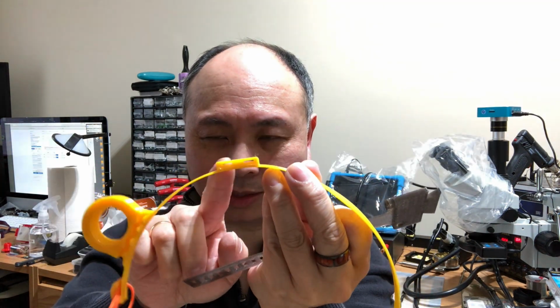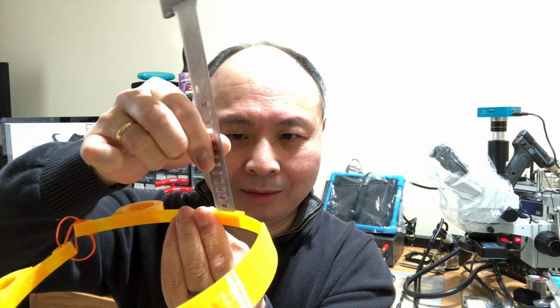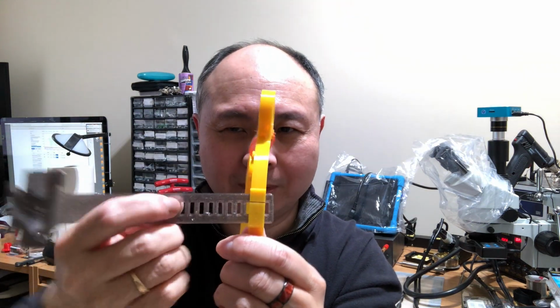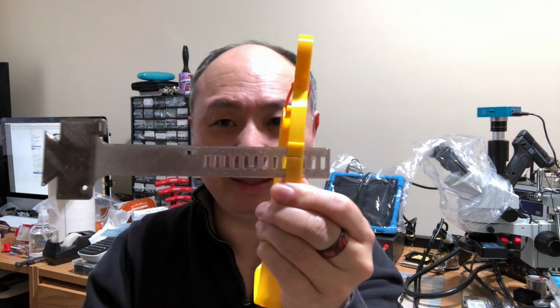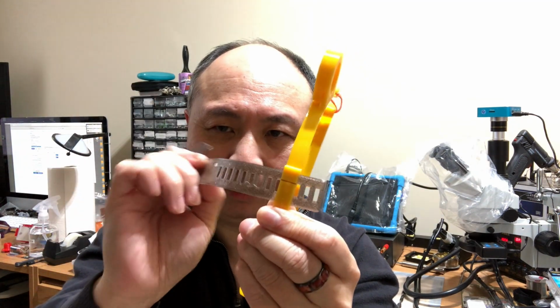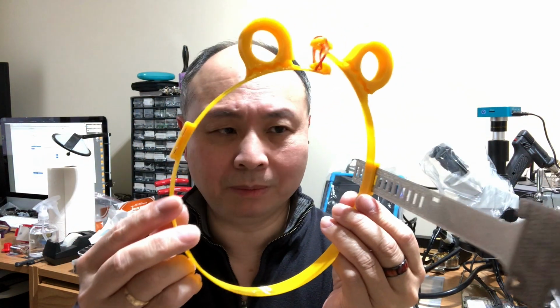Instead, we have a slot into which the fan band is simply inserted, and you click it at each hole position. Just push it to the depth that's appropriate for you. I think that's a lot easier than the old hook arrangement. The fan mounting band is compatible with either the new click slot or the old style hook. But I think this is easier for more people.